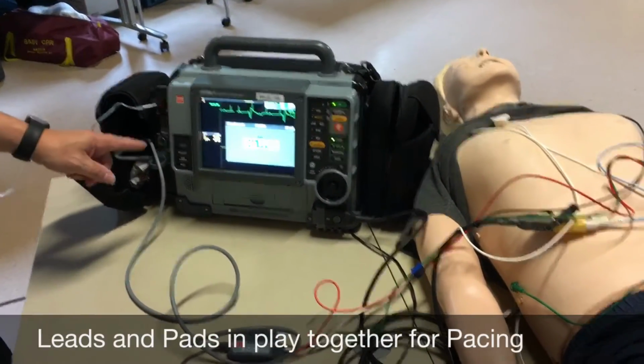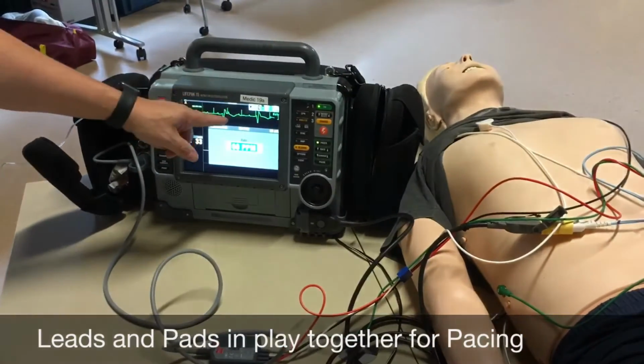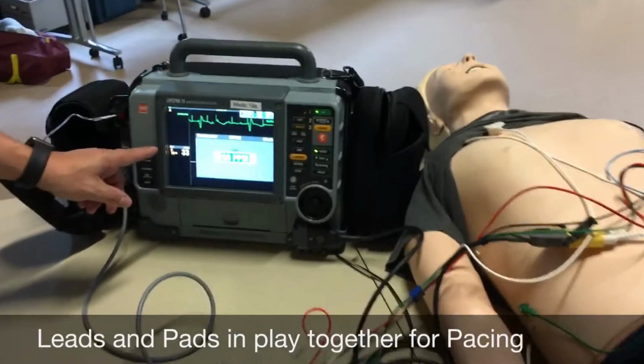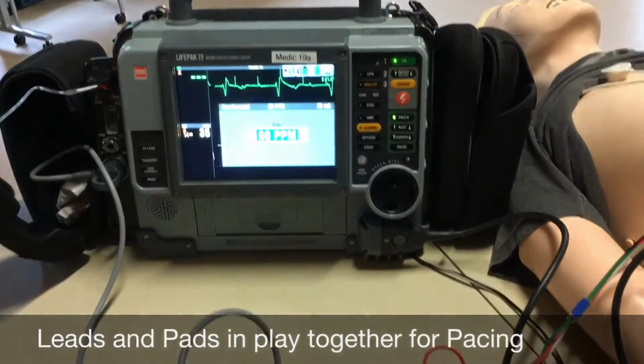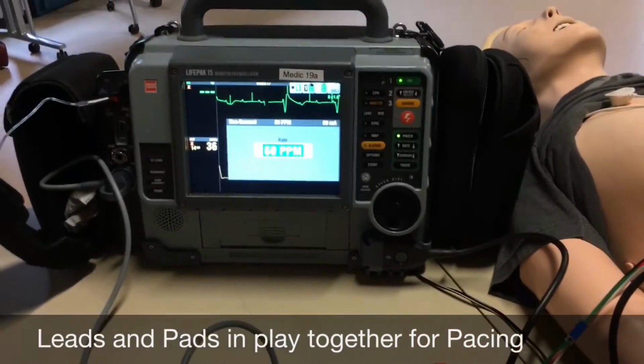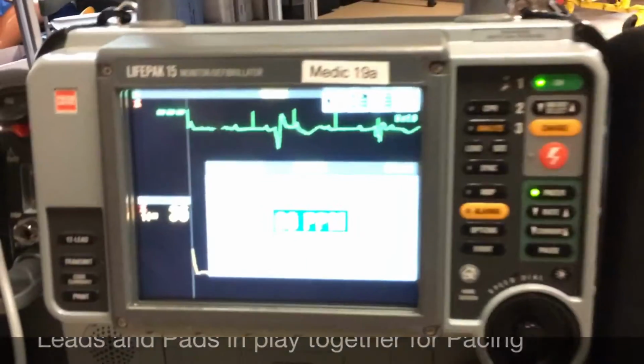So this is not a rhythm that is pacing or getting capture every other beat. This is the intrinsic rhythm, the patient's underlying rhythm, and then pacer spikes at twice the rate of the intrinsic rhythm because we have it set at 60 and the rate is about 30.